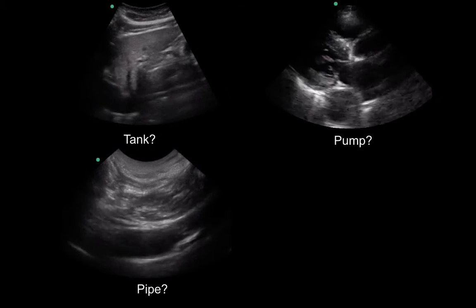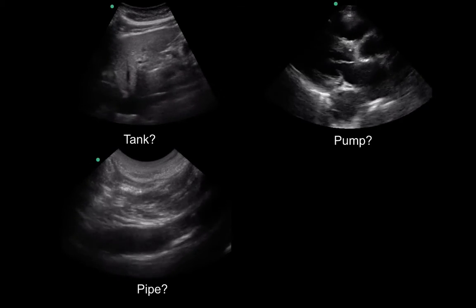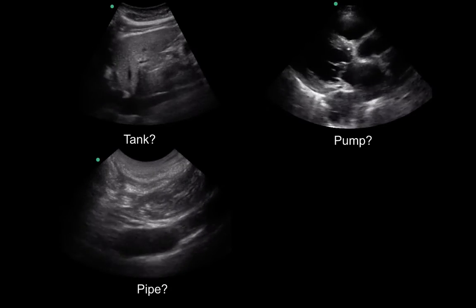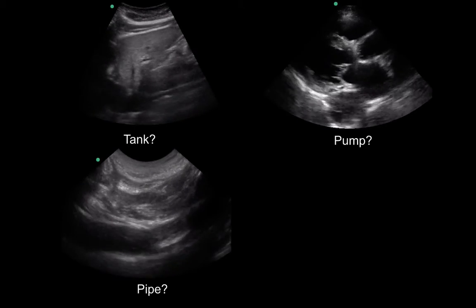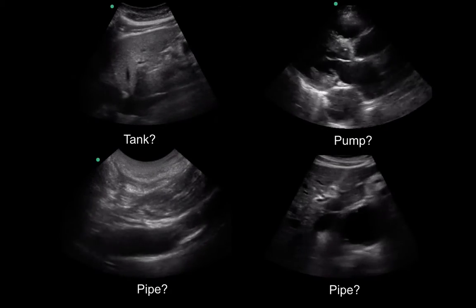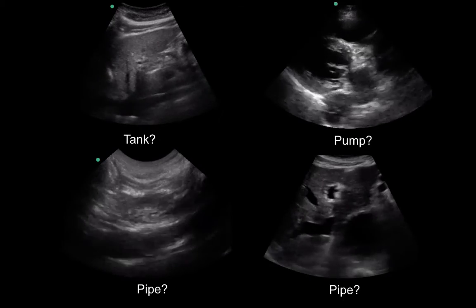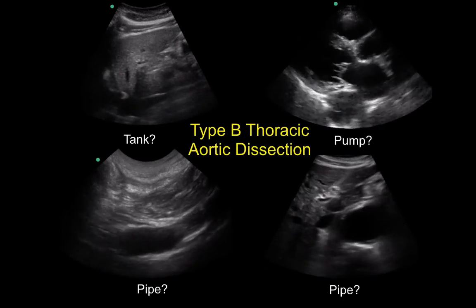This is a view in the suprasternal notch. This is an advanced view, but what we're seeing here is an enlarged aortic arch and an echogenic intimal flap. As we move down into the abdomen, we see aneurysmal dilation of the abdominal aorta. This was a type B thoracic aortic dissection.